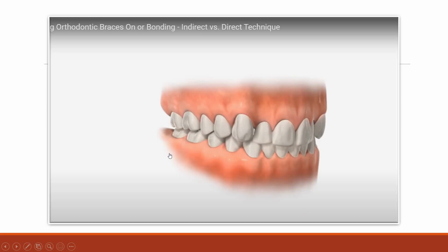Ceramic brackets initially had very high bond strength, which resulted in a significant risk of enamel fracture on debonding. To overcome this, most contemporary systems have a failure point built into the bracket base, which means that when a shear force is applied, the bracket fractures down the midline, collapsing the tie wings of the bracket so that it can be easily removed.